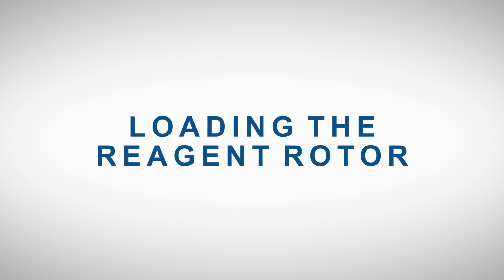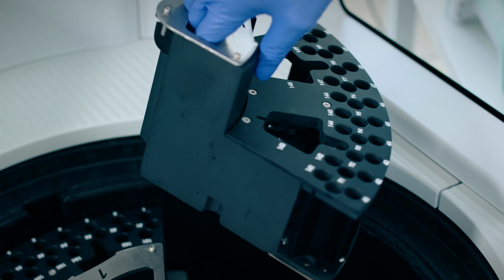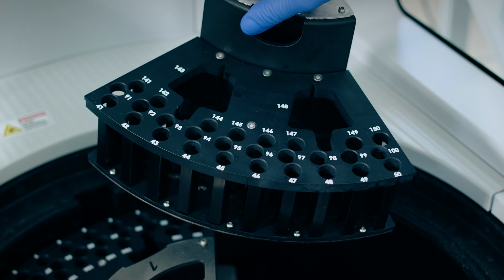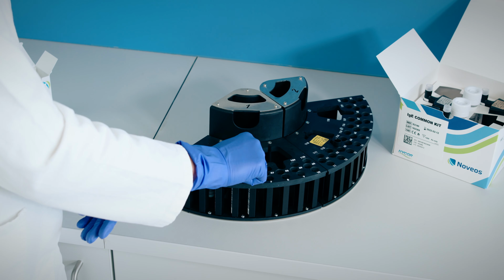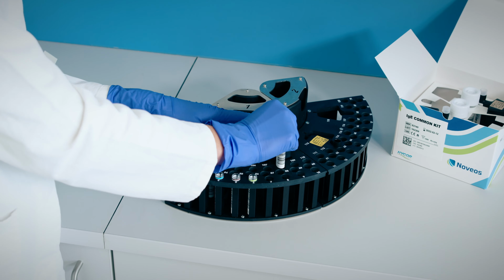Loading the reagent rotor. The reagent rotor has 150 positions, including 10 container positions. It consists of 5 individual removable segments that can be removed for simplified loading or storage. The rotor is loaded with substrate A and B, conjugate, calibrator antibody, and the allergens, also known as capture reagents. It is also important to load the tubes with the barcodes facing outwards in a clearly legible manner.